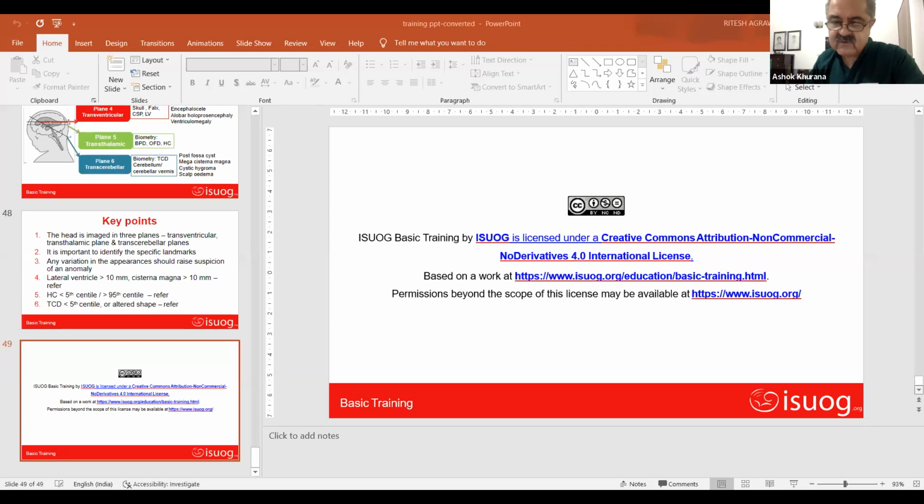What we will continue to learn over the years is that, yes, there are a few abnormalities for which we have to work harder, and for which we have to go in and do a neurosonogram, and that includes other disorders such as those of the posterior cranial fossa, etc., or when we're looking at agenesis of the corpus callosum, or we're looking for some variants of holoprosencephaly that don't fit in instantly. Sometimes you might need to tell the difference between ventriculomegaly and holoprosencephaly. And if you follow the algorithm that she has shown, there is no way that you could miss this.